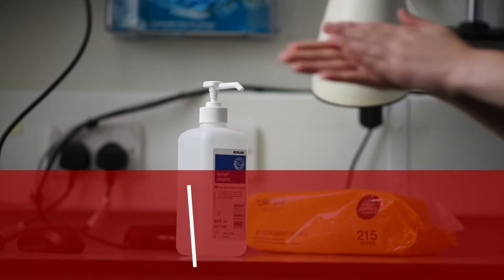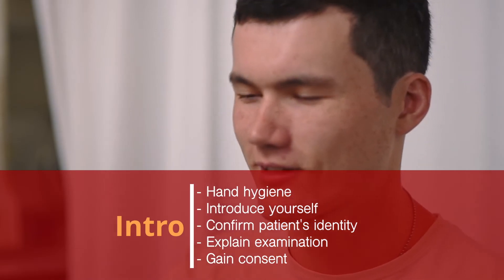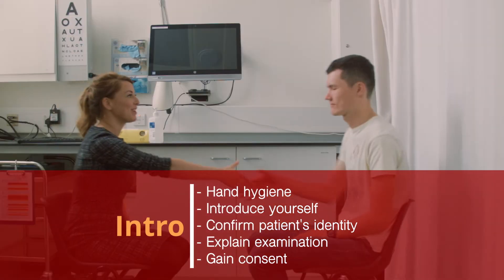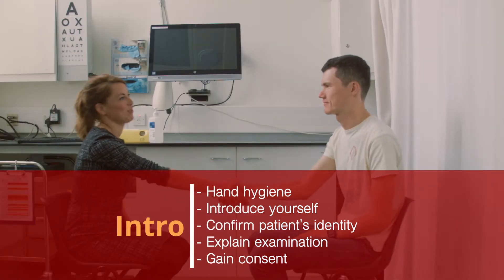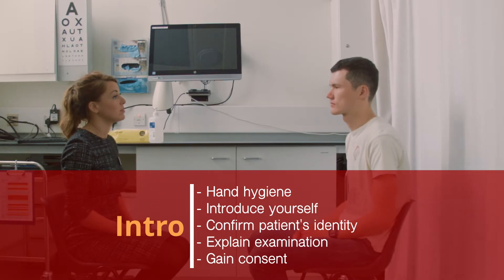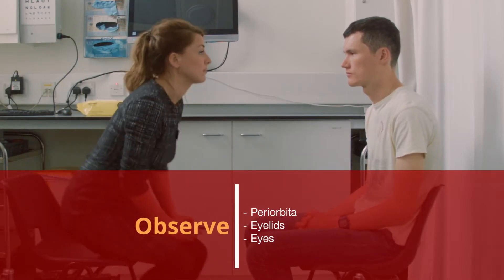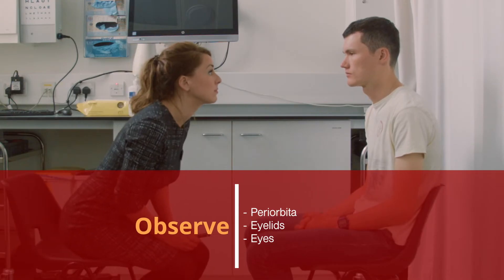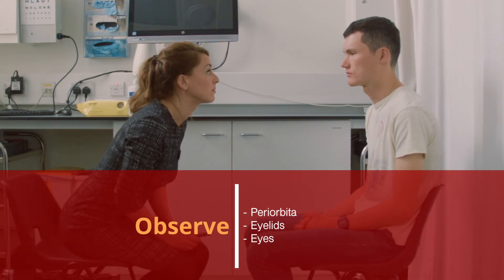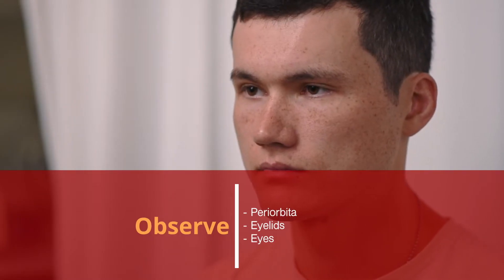Start with hand hygiene and introduce yourself. Confirm the patient's identity, then explain the examination and gain consent to perform it. Take a few seconds to observe the periorbital area, eyelids and the eyes themselves, commenting on any positive or relevant negative findings.